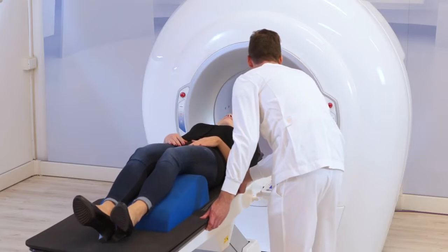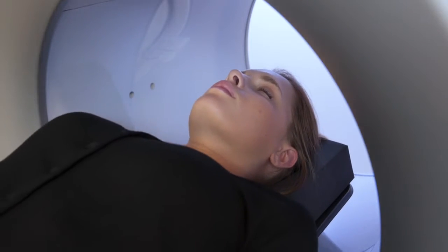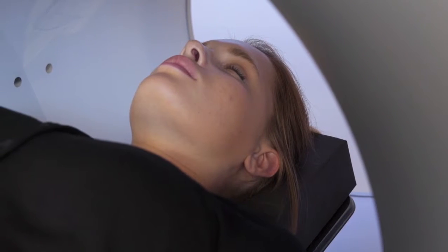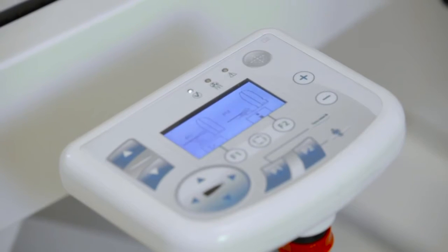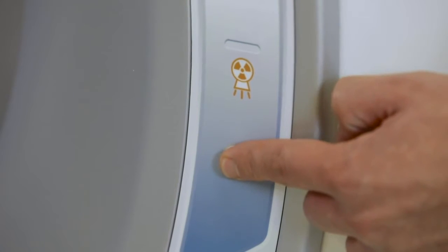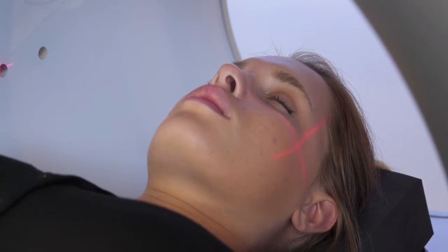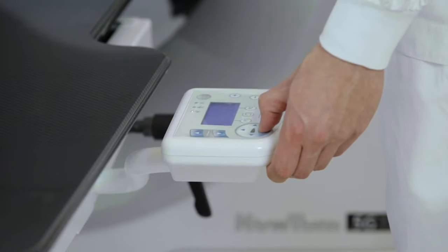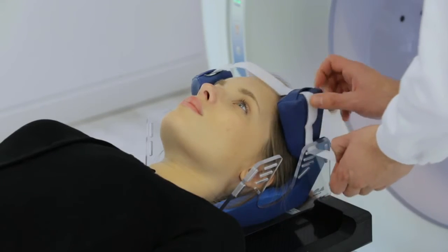Unlock the gurney and slide it to move the patient into the gantry, then lock it again. For precision adjustments, the laser centering device can be used. To activate it, press the laser key on the control console. In this case, it is necessary to have started the NNT software or on keypads on the sides of the scanning unit. Perform a fine adjustment of the patient's position using the movement control keys, up, down, left, right. If necessary, fix the anatomical part with the supplied fixing devices.